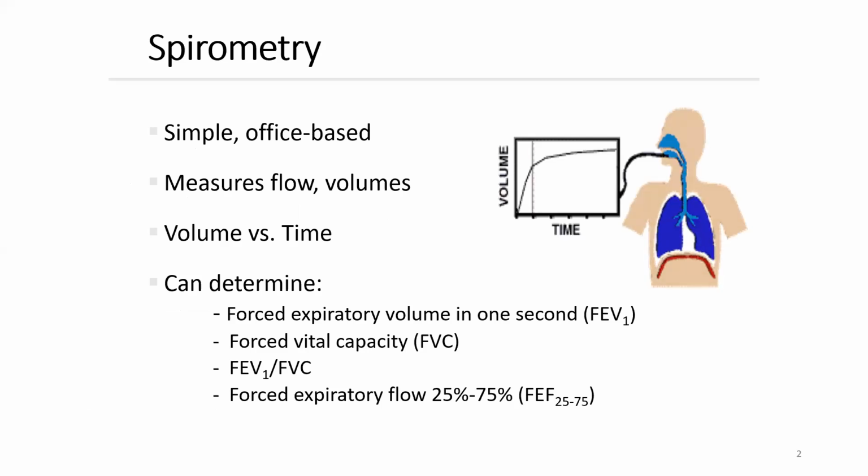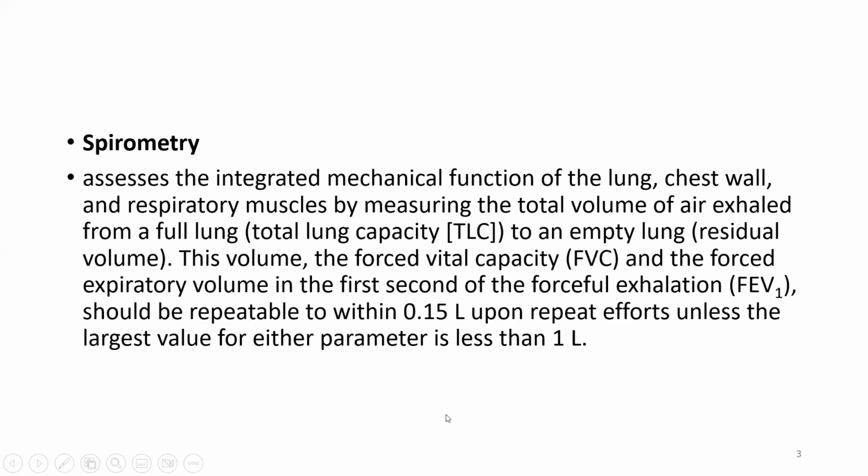This is the spirometry, simple and office-based. It measures flows and volumes, volume versus time. It can determine forced expiratory volume in 1 second, forced vital capacity and the ratio between FEV1 and FVC, and forced expiratory flow 25-75.